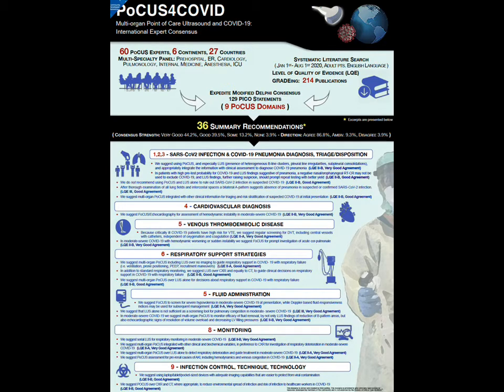So it's quite useful. A big part of the recommendations was infection control. And I think with COVID and isolation requirements, the handheld devices became very useful. These are small enough so that the whole thing can be put into a plastic bag, and then you can do your scanning, and after that it's easier to clean and there's no cross-contamination. So it's very important to do good hygiene and good infection control.